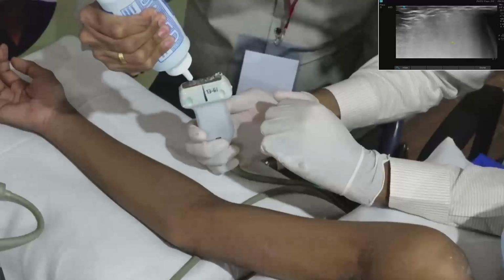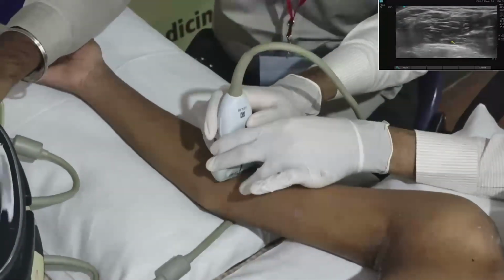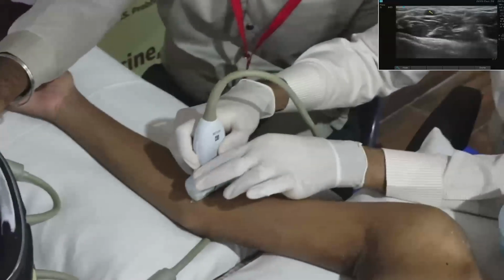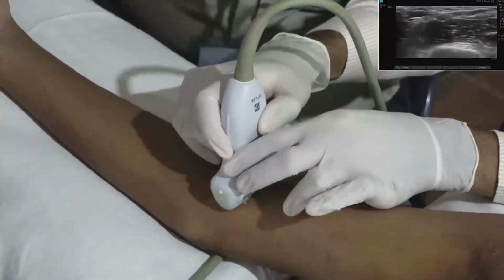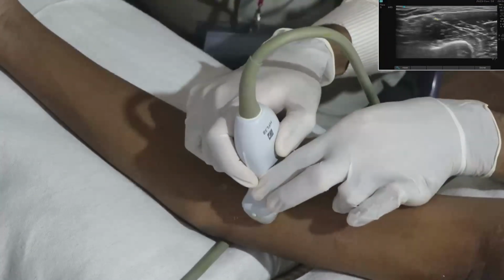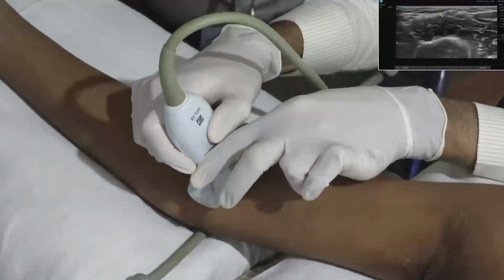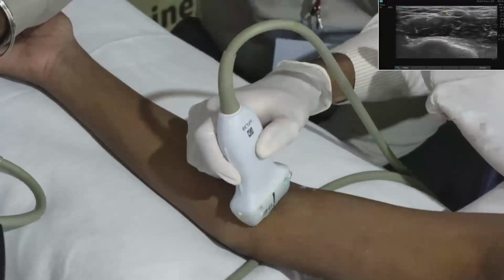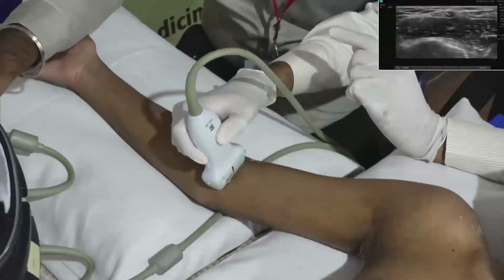Everyone of us knows where the brachial artery is. So if you scan the brachial artery, my marker is towards the medial side. Any nerve structure you are able to see next to the brachial artery, medial to the brachial artery, I am keeping the probe over the elbow. So the honeycomb appearance next to the pulsating brachial artery is the median nerve.